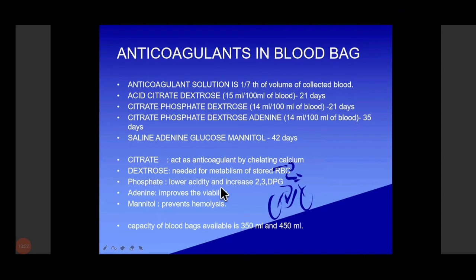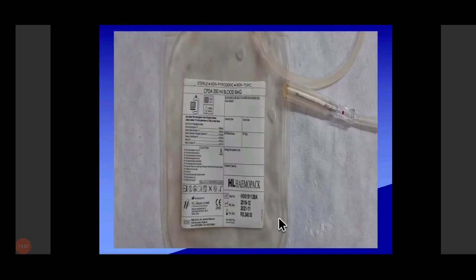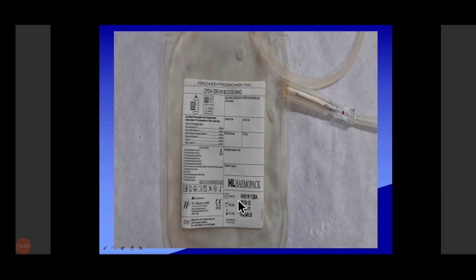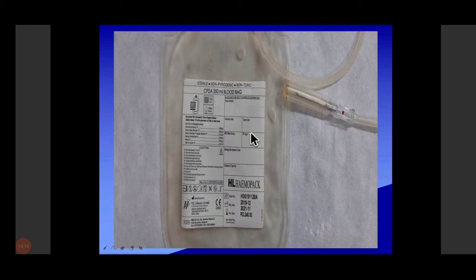The capacity of a blood bag is 350 ml. It contains the anticoagulant CPD-A — citrate phosphate dextrose adenine. The contents are written on the bag. We have to mention the collection date, expiry date, blood group, and whether Rh typing has been done.